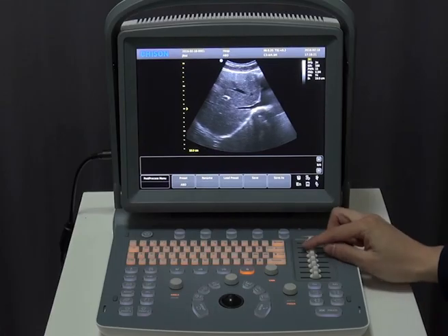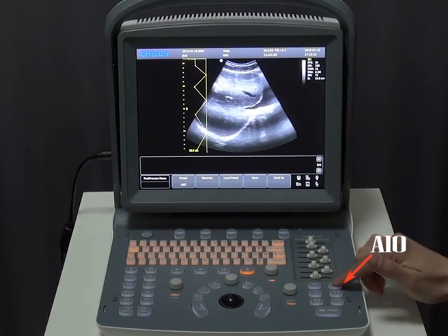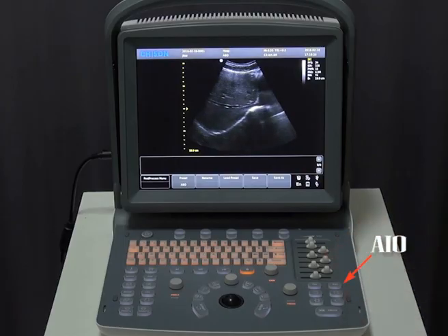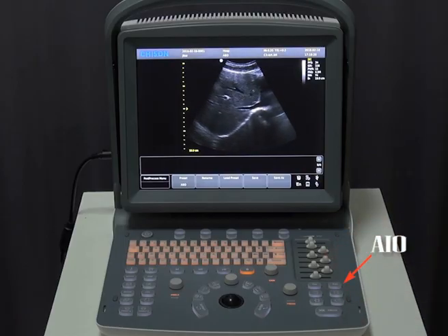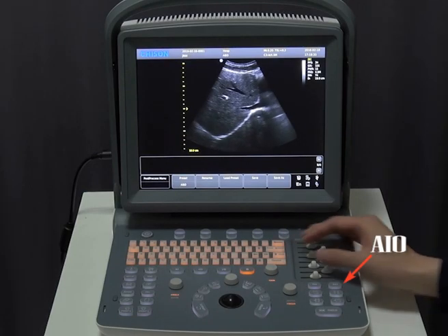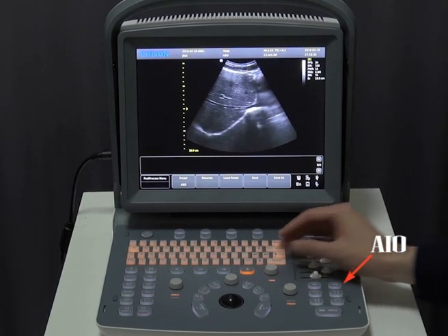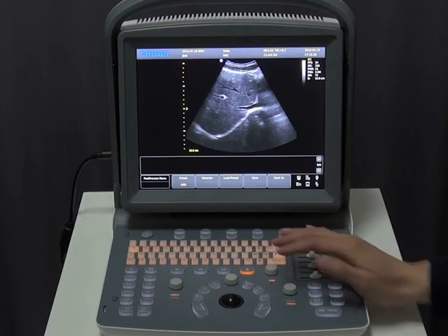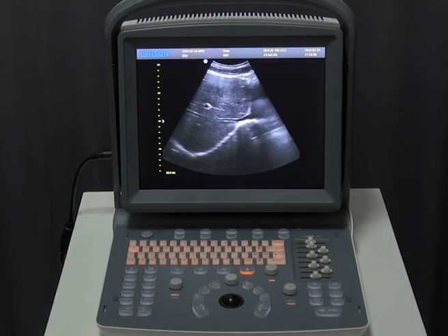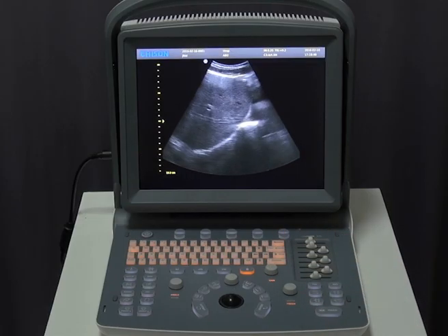What's more, one-key image optimization is available. Press AIO and with just one key, the quality of the image will be set to a suitable status. We also have full screen display mode — press the scan button to enlarge the image to full screen, and press again to go back.